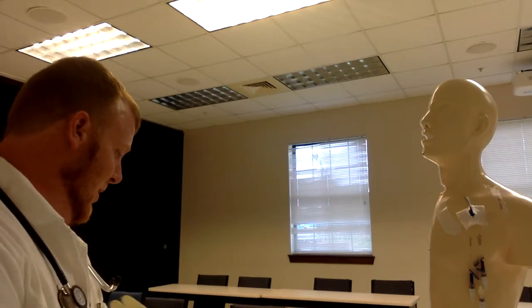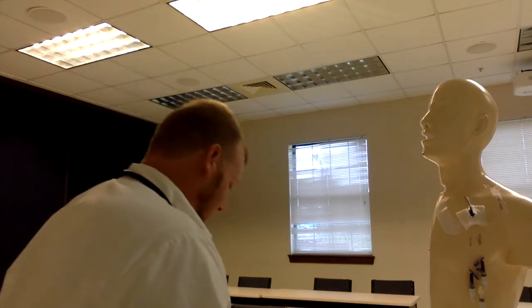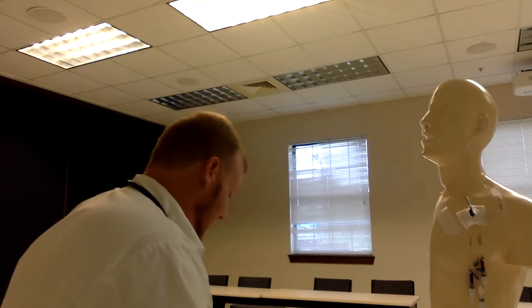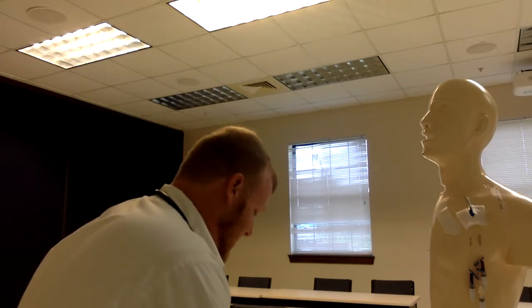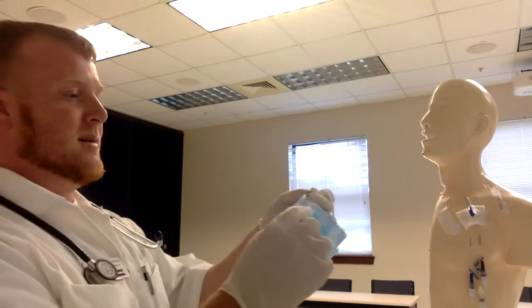Alrighty, so we're going to open up the sterile kit now, and inside of it there are two masks, one for the patient, one for myself. Clean gloves. We're going to open it away from me. Right on top is the patient's mask.